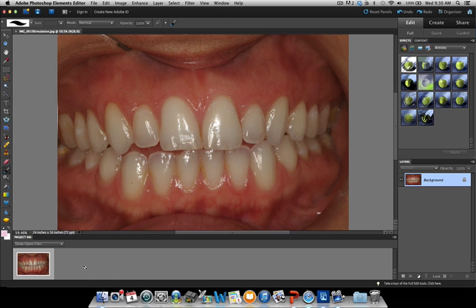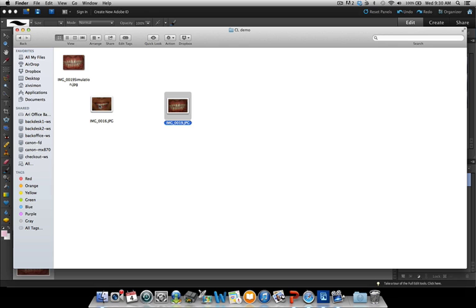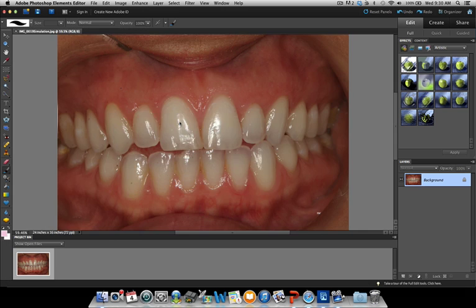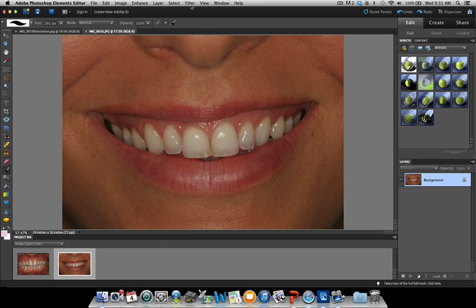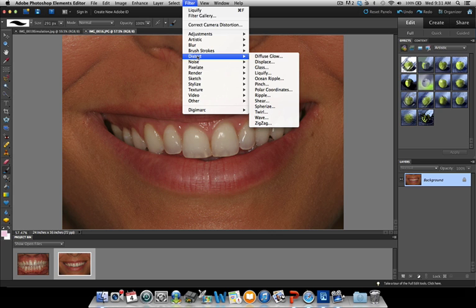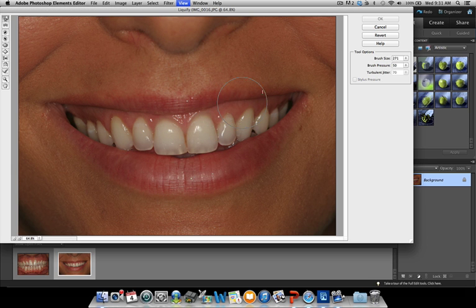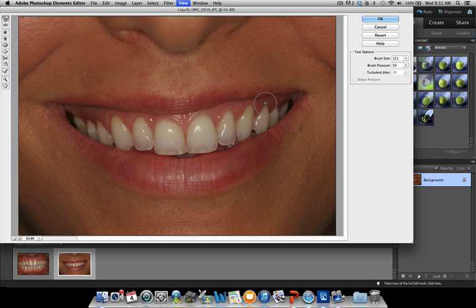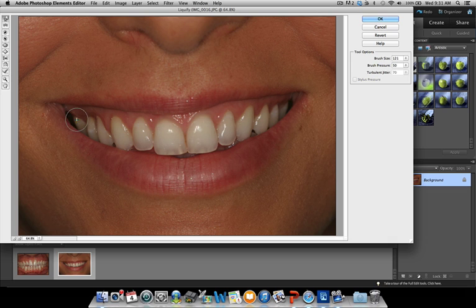Now take the second picture, which is the patient's smile. Do the same thing — go to Filter, Distort, Liquify. Use a smaller brush size so you don't distort the lip too much. You can start changing the gum level in a very seamless way. If you made a mistake, you can undo it — it's all in the digital world, it doesn't even hurt the patient. The information and knowledge you gain from doing the simulation helps you a lot.